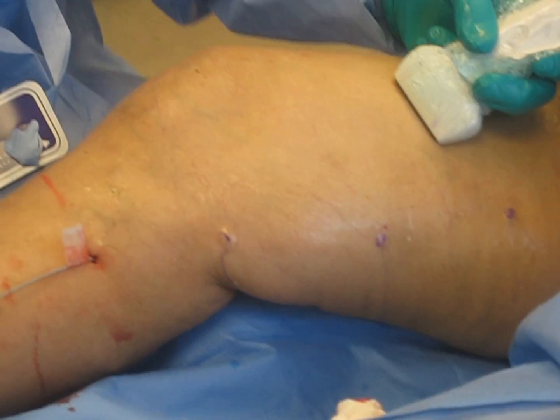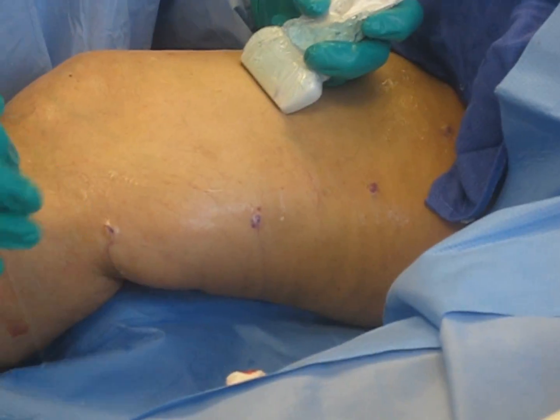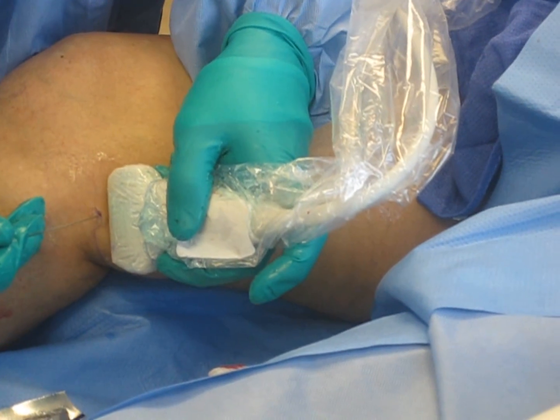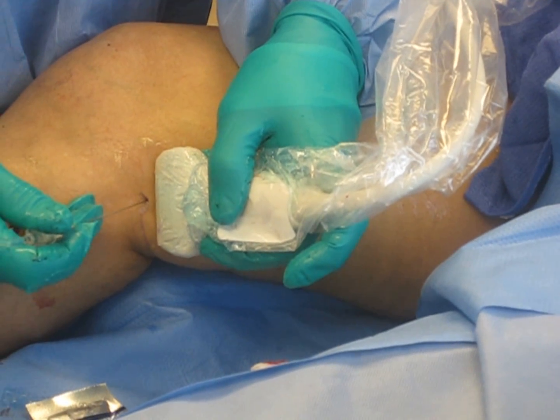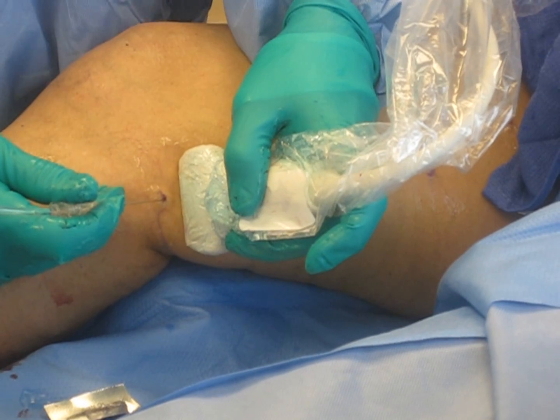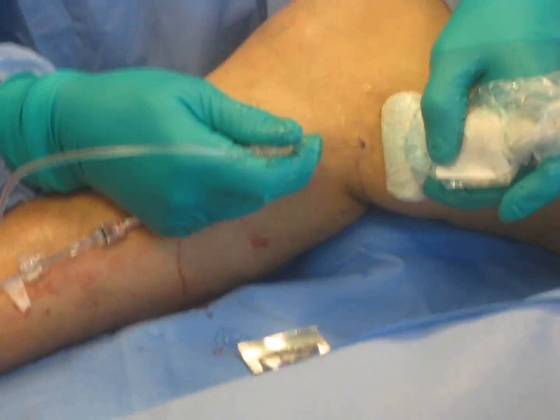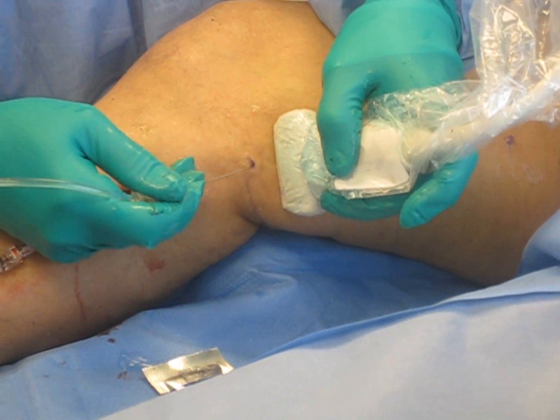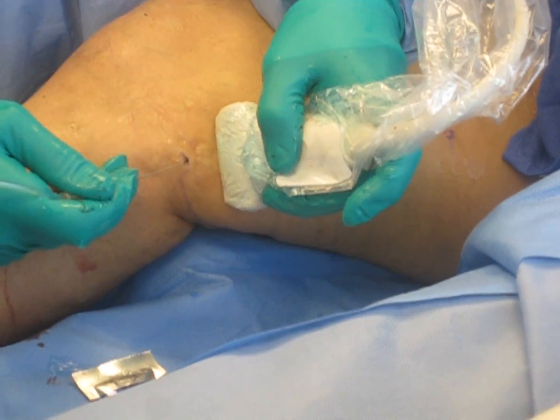Once I get this step going, patients are usually completely anesthetized. You will feel pressure — you will feel the anesthesia around the vein. We're pumping fluid all the way around this vein. Everything's fine — todo va bien.